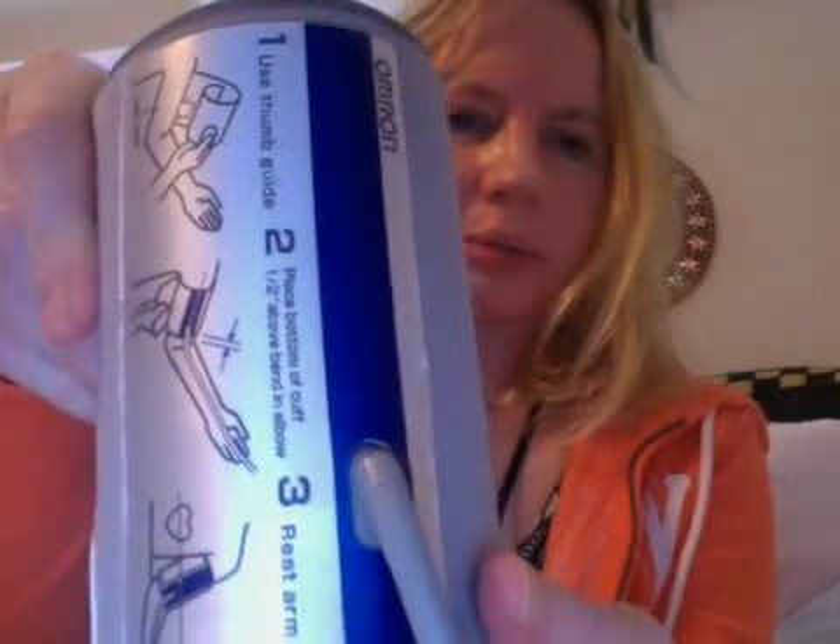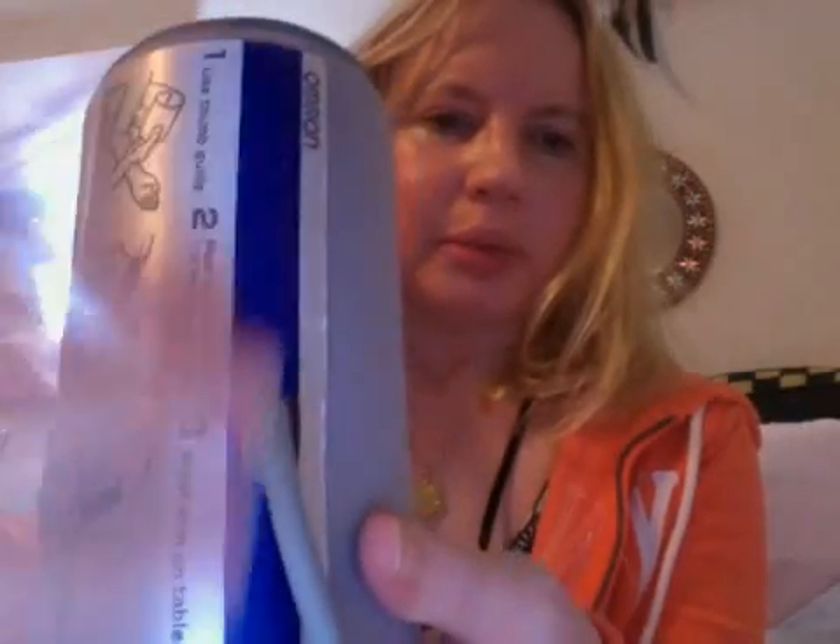You can see this one comes with a nice big cuff — it can fit someone who has a larger arm. It shows you where you're supposed to place the cuff on your arm. The bottom is about half an inch above your elbow, and this part with the cord is facing down. You should always take your blood pressure not over a heavy sleeve, but on your bare arm.